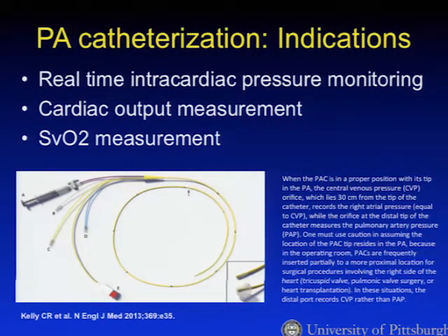So ignoring the predictive value of wedge pressure, we're left with these remaining indications for Swan-Ganz catheterization: real-time monitoring of intracardiac pressures, cardiac output measurement, and mixed venous oxygen saturations.